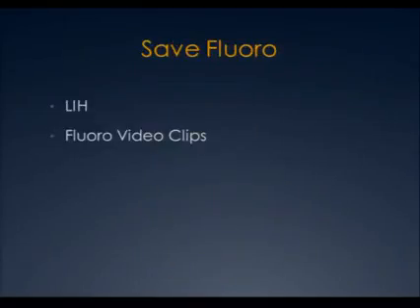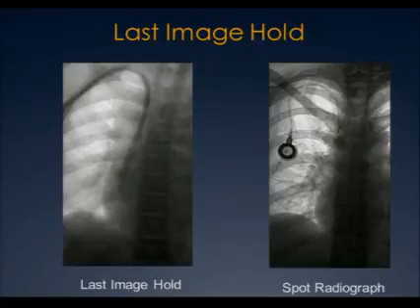Now, as I've learned about this, the thing that I like to use most on the new machines are fluoro video clips. The fluoro video clips will tell me a lot of information without me mashing on the pedal while I'm standing in the room and doing a DSA run, or just last image hold. And again, as I'm using that with the house staff, with the fellows and the residents, they are all adopting it. And even now, finally, the faculty are switching over too.